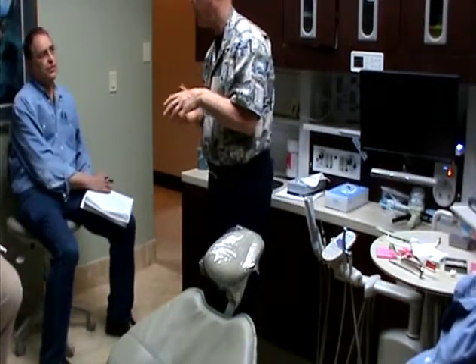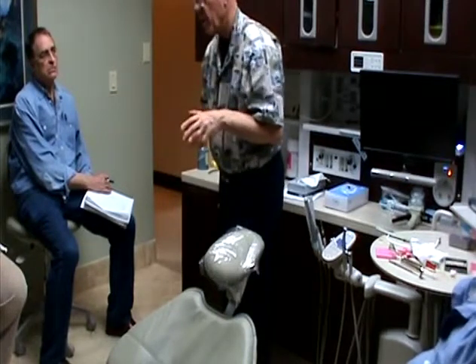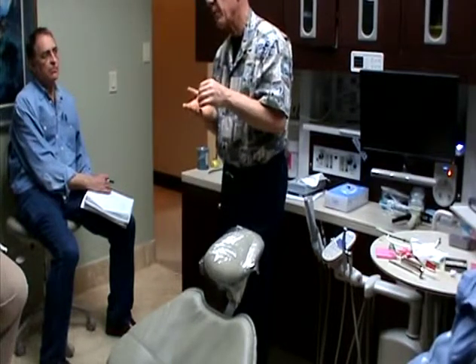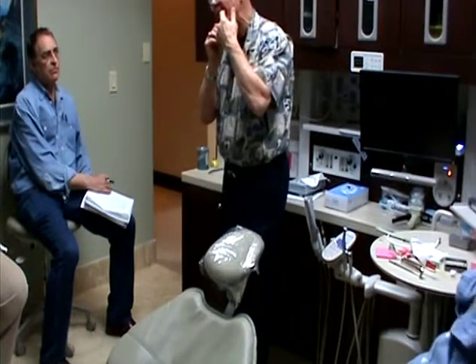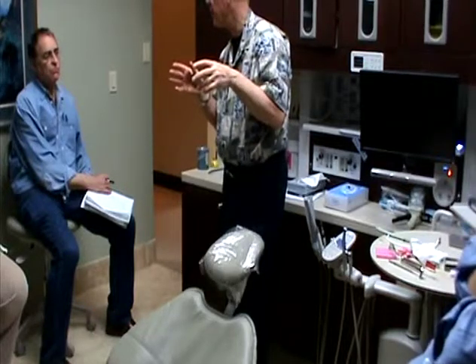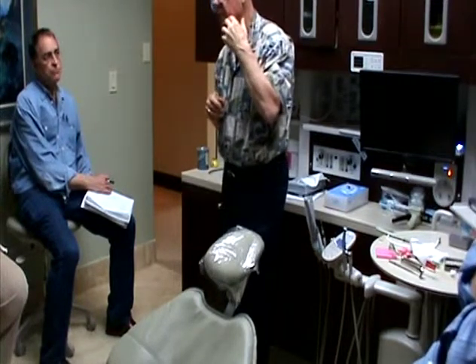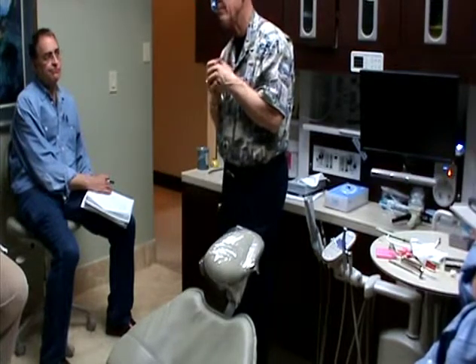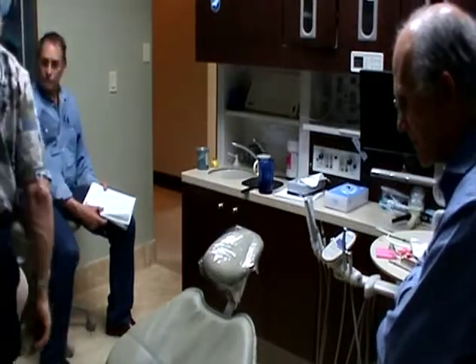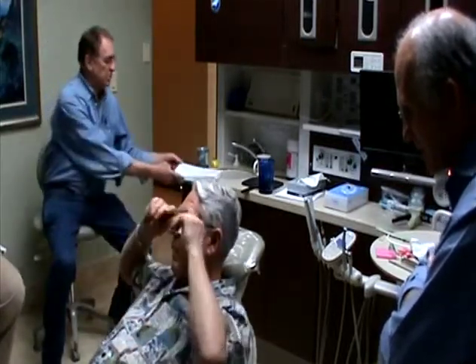Is this for final restoration? No, composite on a hard split appliance. If you do it in the mouth or on the Aculiner, you get it all set up so it's right, and you tap it in, and when the Aculiner is closed, you set the material. Or if you're in the mouth, you tap it in, and when it's closed, you set it. You don't let them open the mouth and set it on top. Right, you have to do it closed. It rebounds no matter what you do. You do one side, get your centric balance, then do the other side, close, set it, and then do your centric balance. That's the only thing we didn't do. So you're saying it needs to be closed. You can't let them open up because it rebounds, and you'll take a lot more time to adjust it.